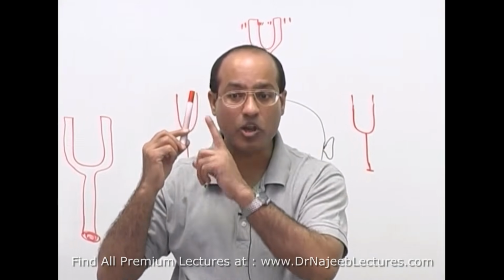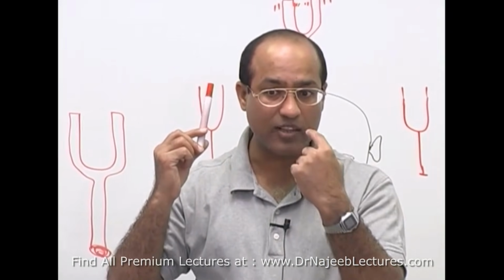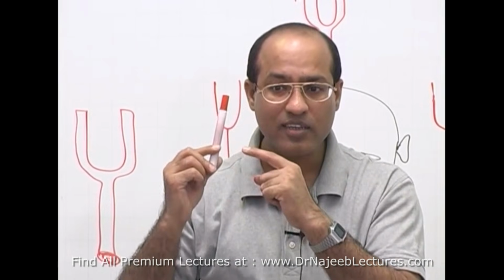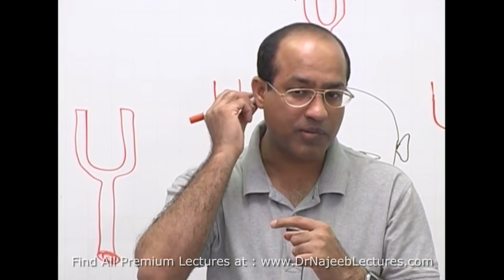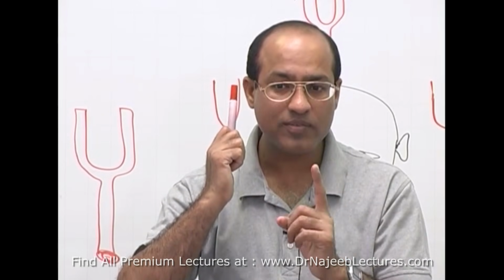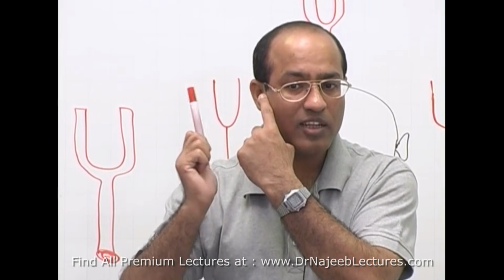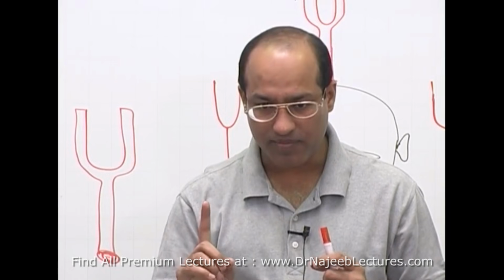If my ear is normal, or if my ears are conducting well through the air, then air conduction should be longer than bone conduction. So it means that when the tuning fork stopped vibrating on the bone conduction, you bring it here, and the person should hear. If the person hears, it means air conduction is more than bone conduction. This is normal, right?